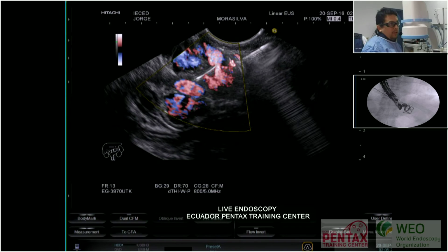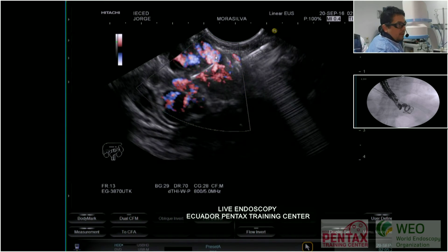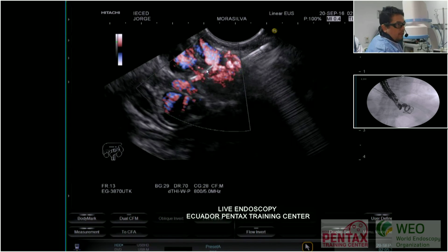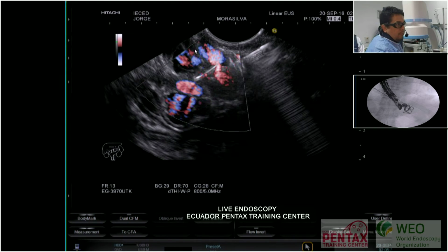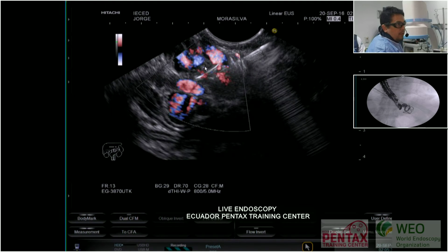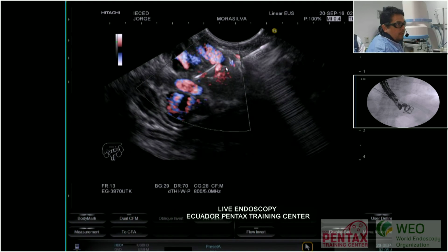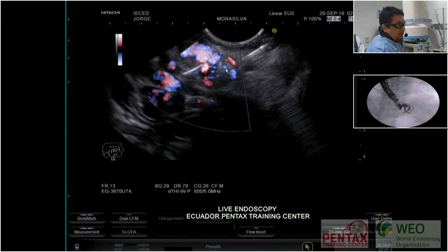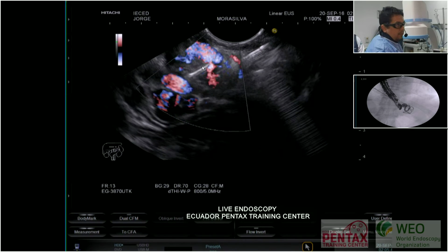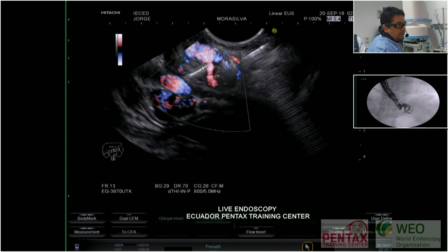Okay, so we can see the diminish of the fluid inside of the vessel. Okay, so now we have a very good initial response. This is very good. Okay, so we don't have a very good nutrition of the vessels here now after the coil. So we will put now the injection of cyanoacrylate. So we don't need to retire our needle, only we will flush with saline solution.